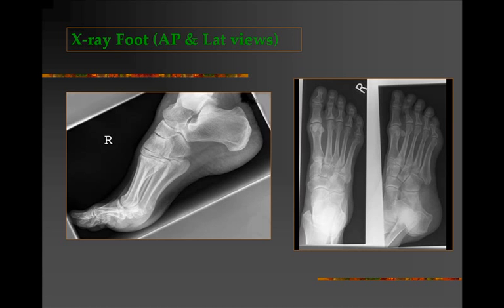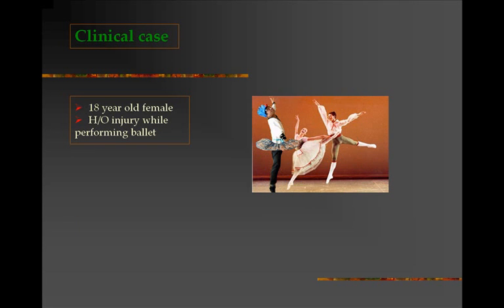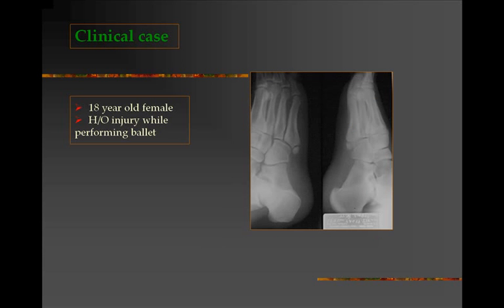Here we have normal x-rays of the foot. The lateral view shows the tarsal bones, the metatarsals, and the phalanges, and the longitudinal arch of the foot is clearly seen. The AP view shows the first to fifth metatarsals and associated phalanges, and an oblique view also shows the metatarsals and phalanges. A clinical case of an 18-year-old female patient who sustained injury while performing ballet shows a fracture at the base of the fifth metatarsal on x-ray of the right foot.